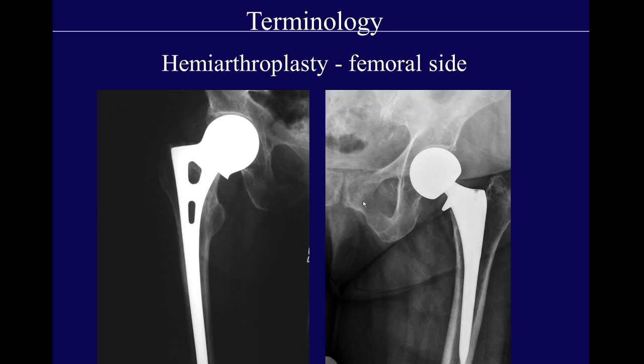Here are two different examples of femoral hemiarthroplasties. This is a monoblock stem, meaning it's one big piece of metal with a head on the stem. And this one is also a unipolar hemiarthroplasty, but it's a modular head, meaning that they've picked a head that they can then match with the stem.